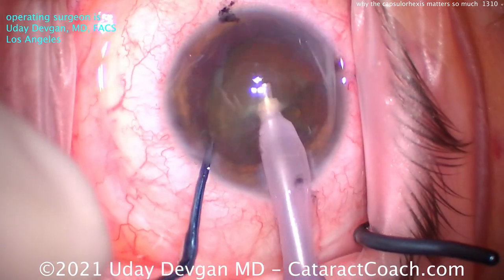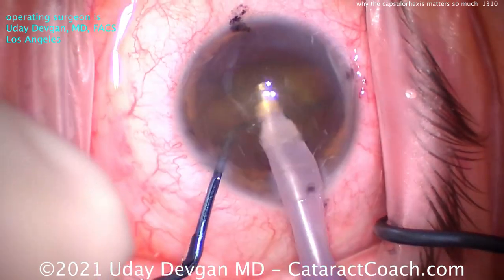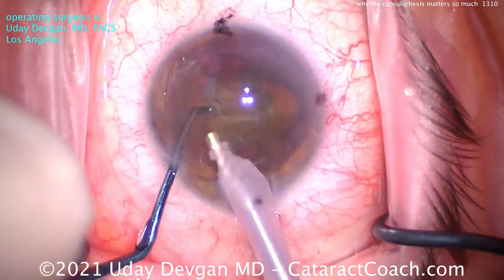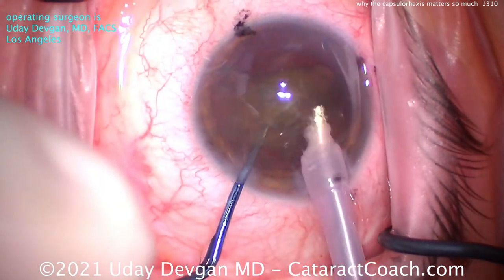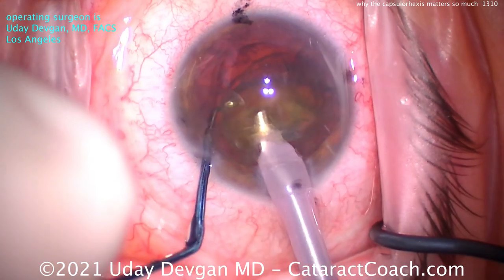There's a real strength in making a capsular rhexis. So we can emulsify this cataract, chop it up into pieces, and we'll partially prolapse it out of the capsular bag — I'll frequently do that. So that's one important reason: you need to have a strong capsule opening.